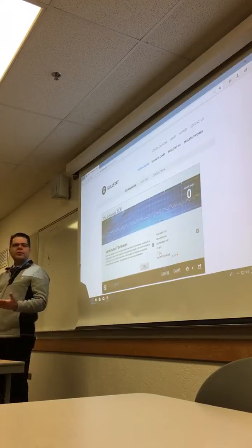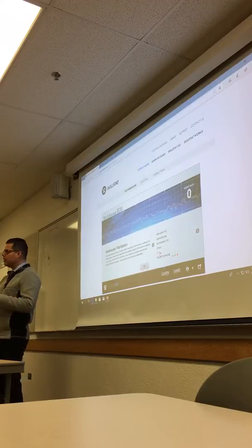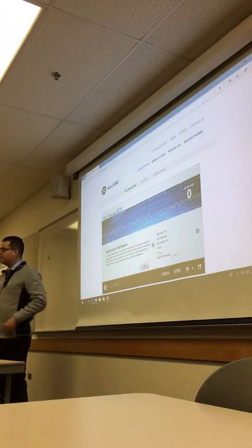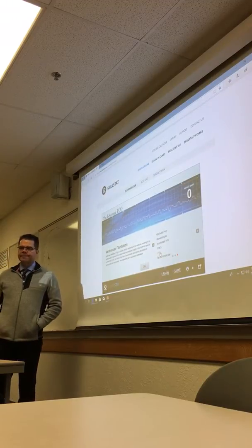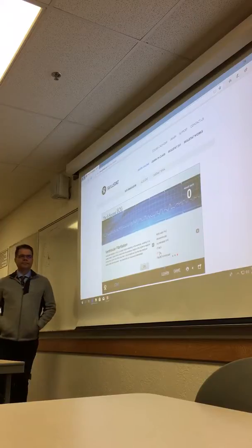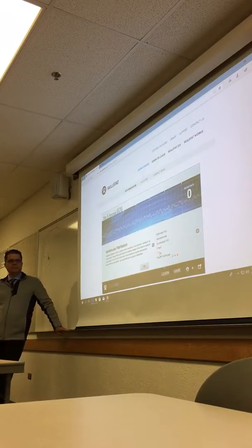And they're lasting a long time now, up to 8 years or so, but generally they have to go in and replace the battery pack and do all that other stuff. Do they leave the original? No. So I was telling my clinical group at post conference, we were talking about these defibs a little, and that's something we're starting to deal with that we haven't really dealt with in the past.